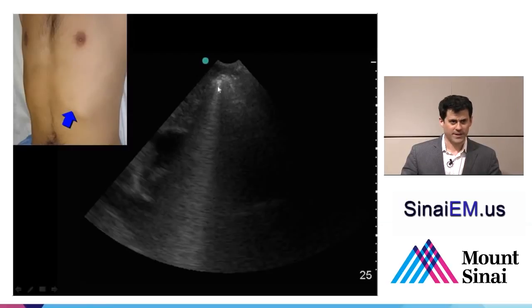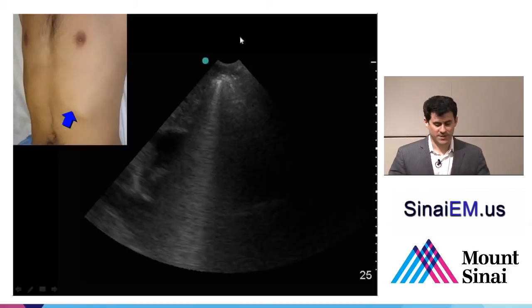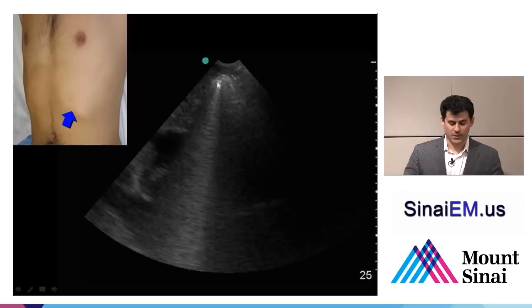And if you look, there's this bright reflector up near the top of the screen that's causing all this reverberation to come down. And everything on this side of the screen is really poorly visualized behind this bright white reflector. This little sliver here, you see a different gray echo texture, and then bright white, and then dark, and there's something there. So we're getting some image information here. We're getting no image information here because of an incredibly bright reflector that's causing a reverberation artifact. And if you think about the anatomy in this area, that bright white reflector causing reverberation artifact behind it, which has to be a very different density than liquid, is the stomach, filled with air, causing no ultrasound energy to pass through it. So it all gets scattered at this point, which makes this area look very bright and causes only reverberation behind it.